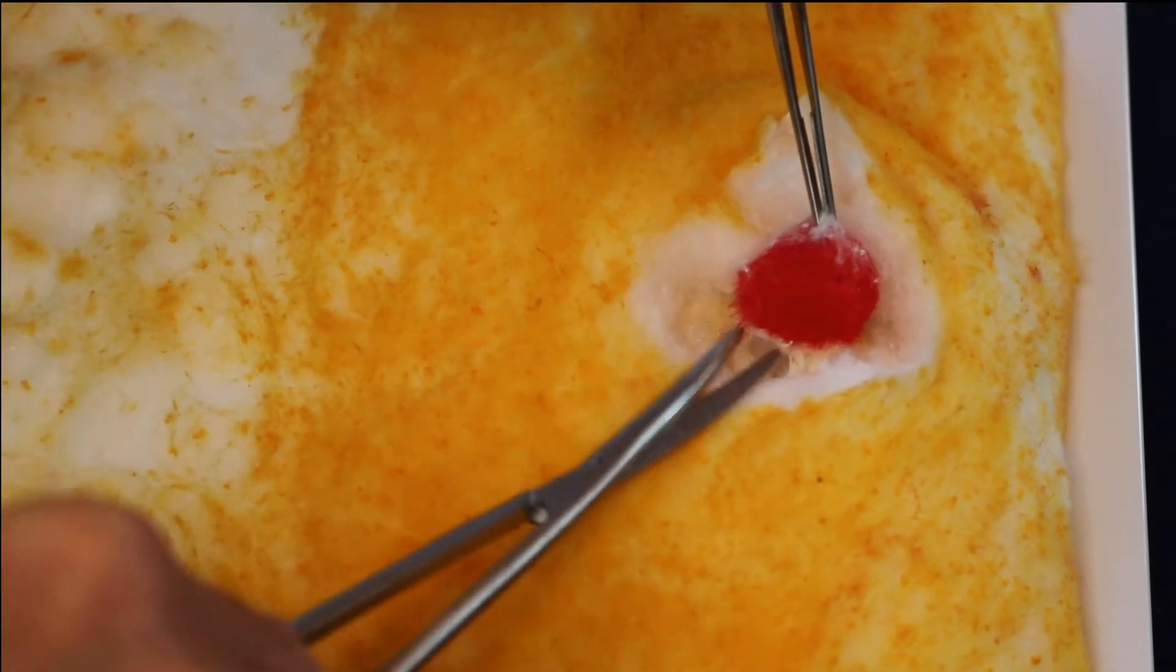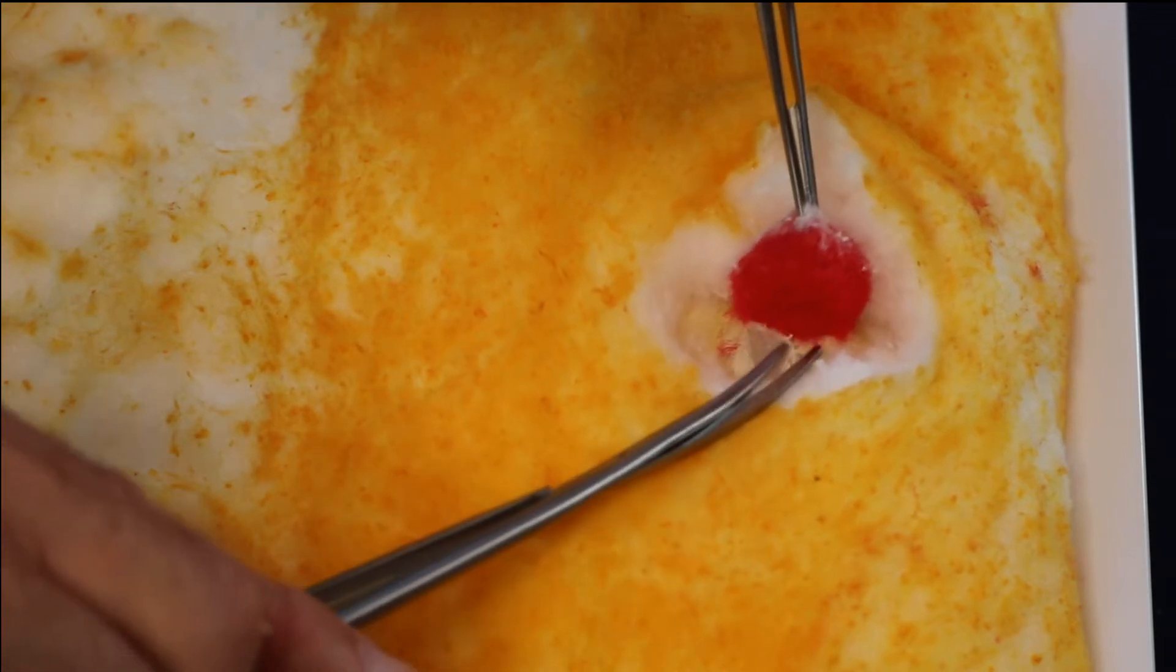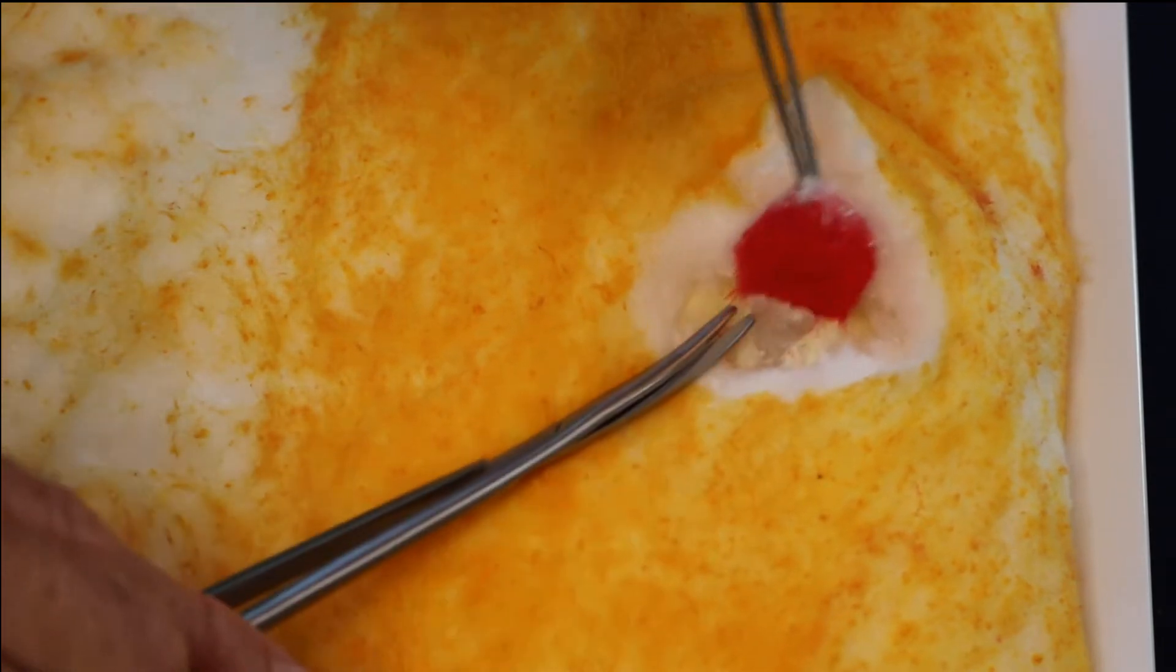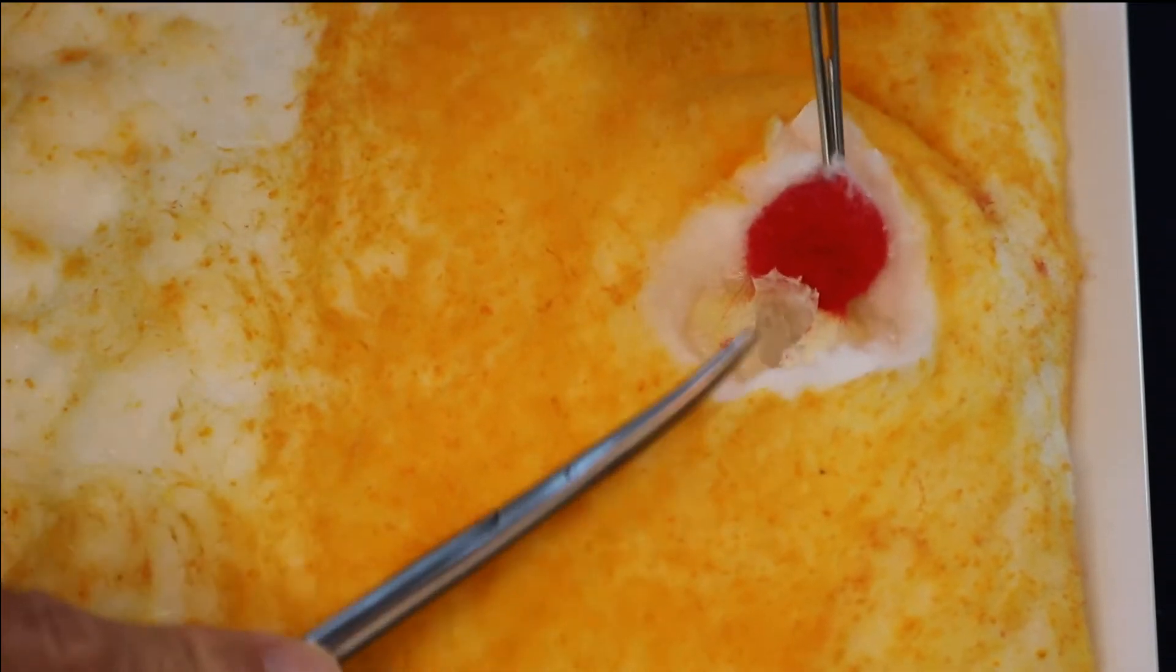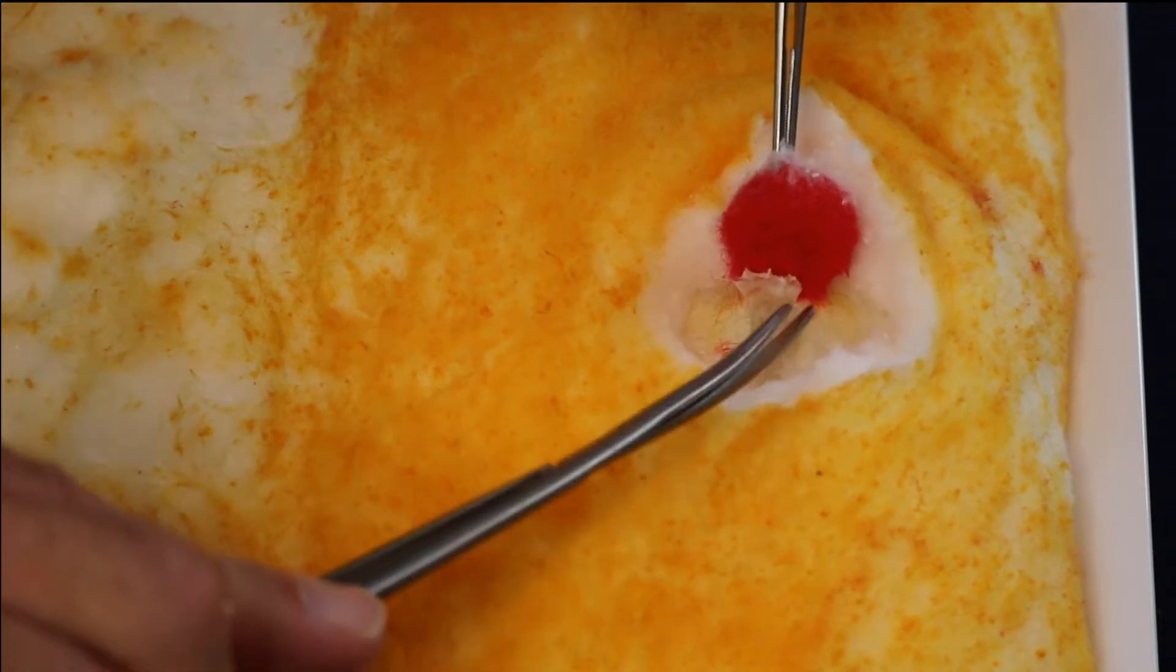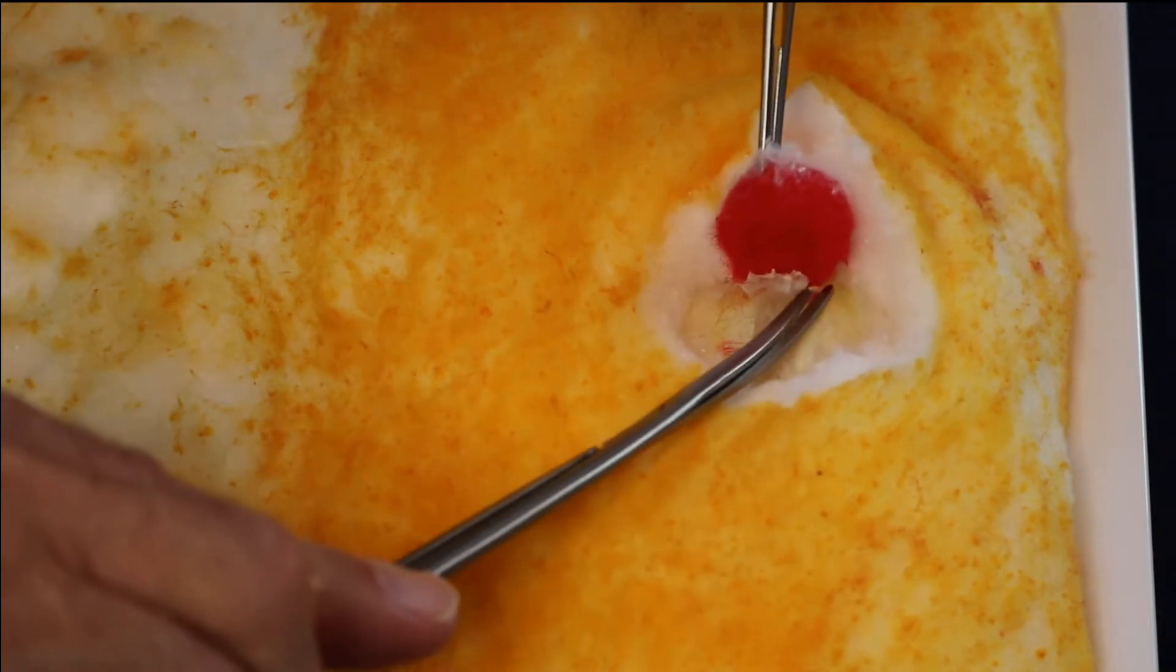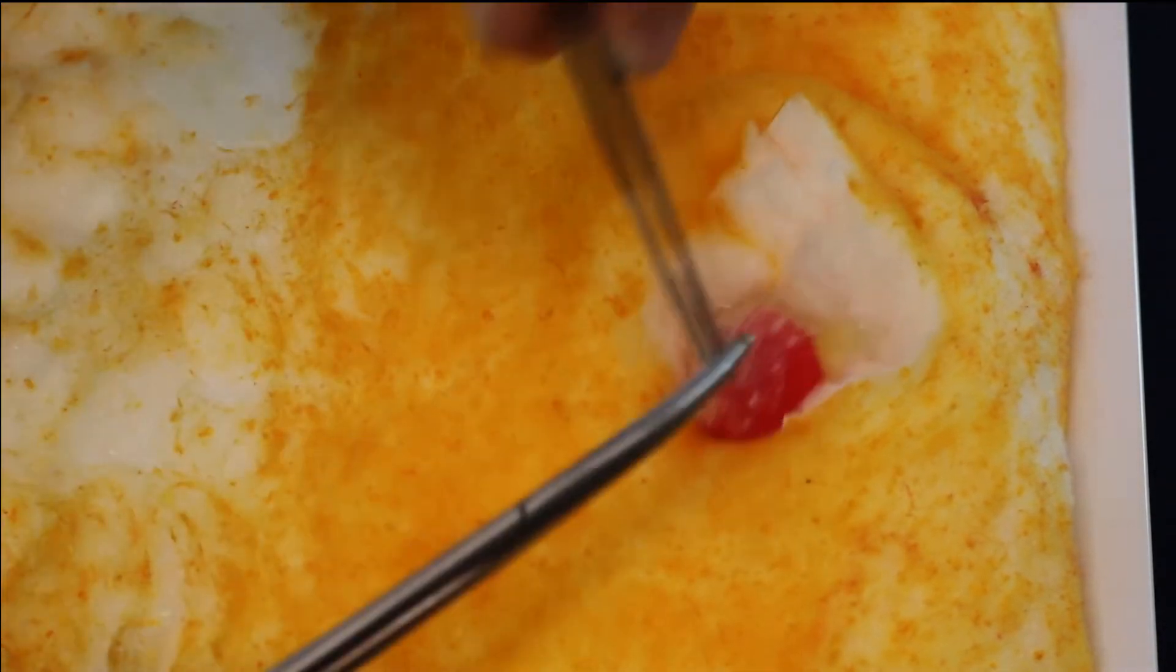A major part of your success in removing this mass will be the amount of tension you apply to the area to be dissected. Upward retraction is critical, particularly as you address the undersurface of the mass to be dissected. Again, try to maintain a plane as close as possible to the mass with the removal of as little surrounding tissue as possible.